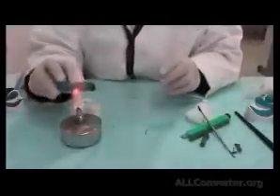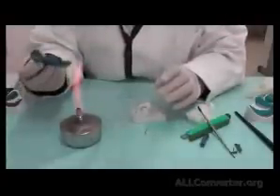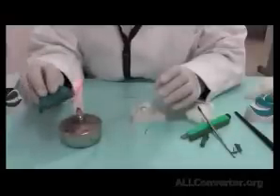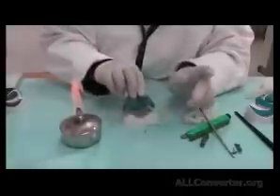I'm heating it once more, tempering it. Why am I going to repeat it? Because I want it as fine as possible. And this time I'm going to heat the whole posterior margin. This will take the final impression of the posterior area. So from this tubercle to this tubercle. Cool it down with warm water.